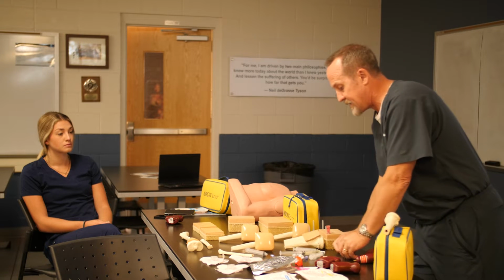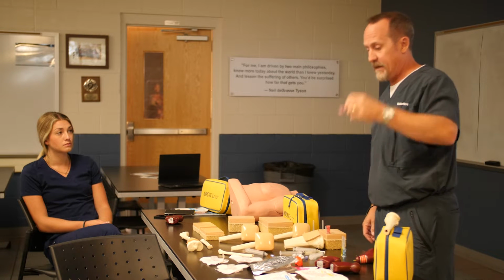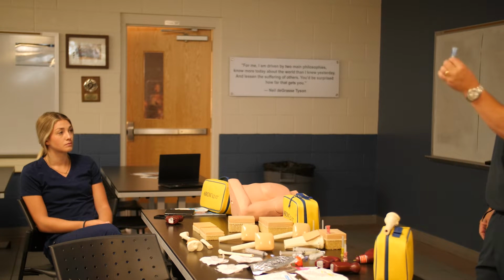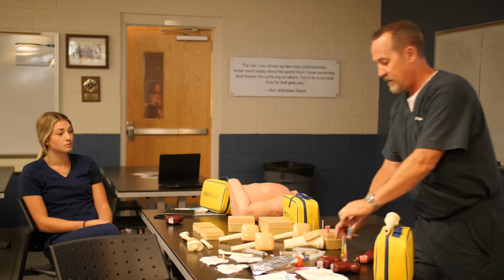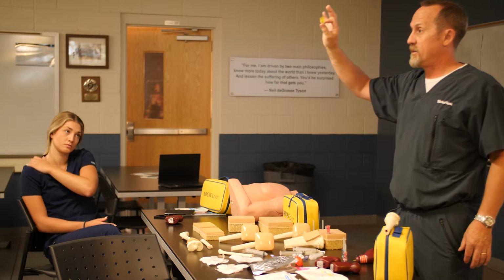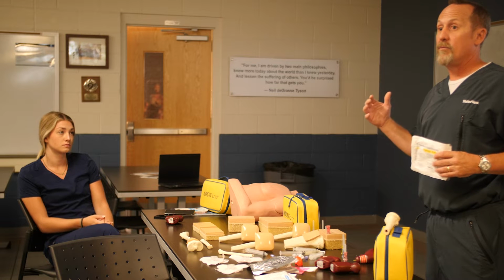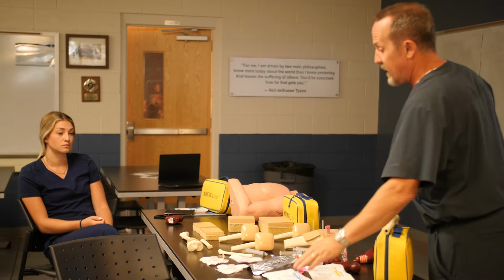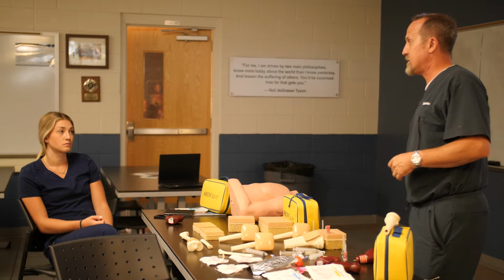So the way I always talk about these needles to really simplify it is pink is going to be pediatric, your little tiny patients. Blue, like the ocean down below, if you're going into the legs, this is going to be the needle choice for pretty much 90% of your patient population, okay? And then yellow, like the sun up above. If you're going into the proximal humerus, this is going to be your needle selection. So, real easy. You guys are in a code situation, and you decide I'm going humerus, grab a yellow kit. If you're going to go into the legs on an adult, grab the blue kit. If you're going into a pediatric patient, typically you're going to go with the pink, okay? Any questions on that?